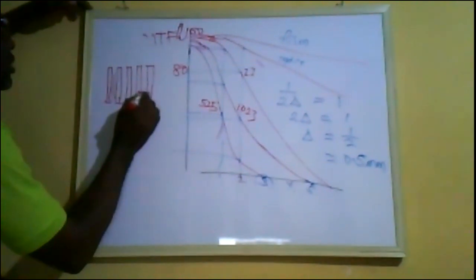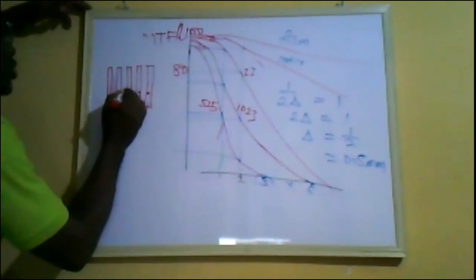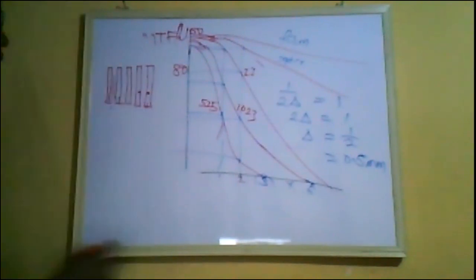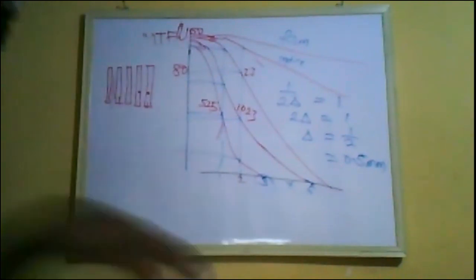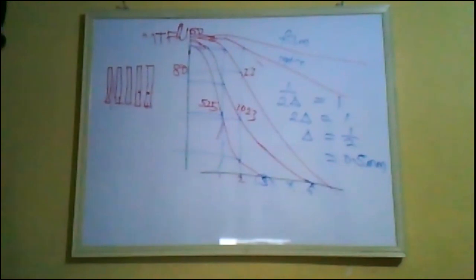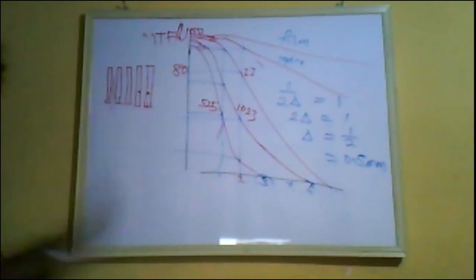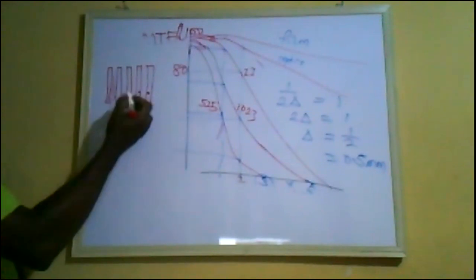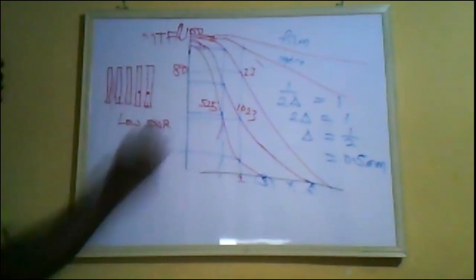You have a structure, and at some point in time it's going to disappear. But in this one, this structure is not there. This structure is not in this particular frame because they are actually different events. You can have maybe 100 frames in a particular minute or whatever. So this is what we are looking for. This frame is the one that captures the information very well. But if you use this, you're going to have low SNR, low signal to noise ratio.